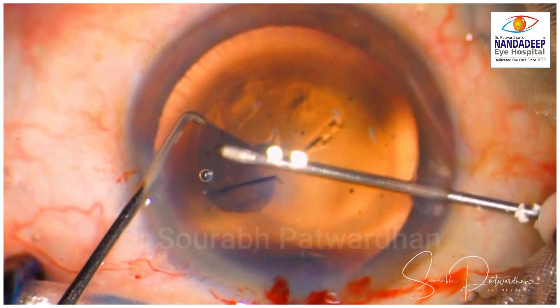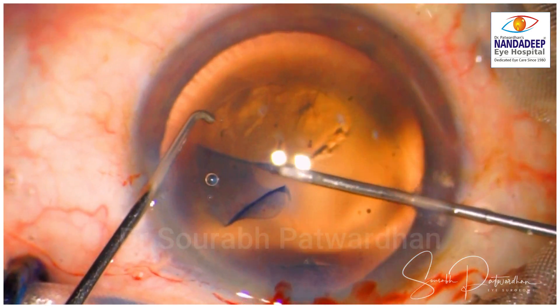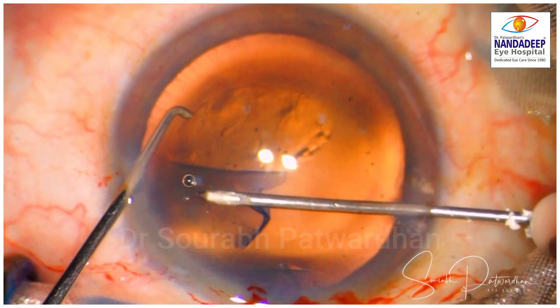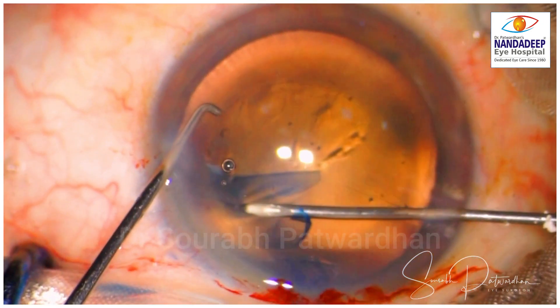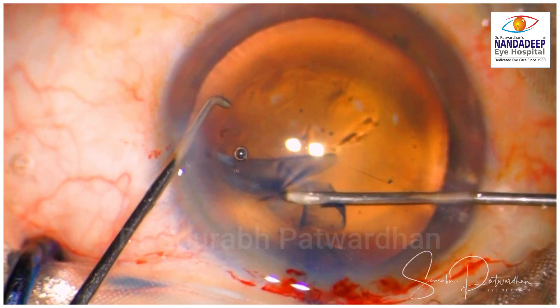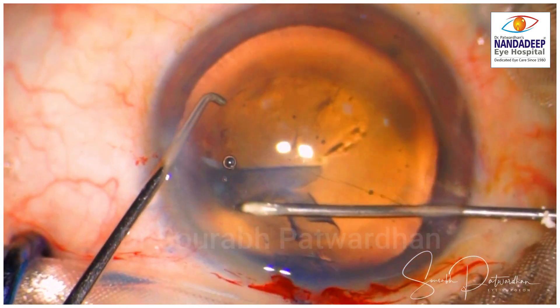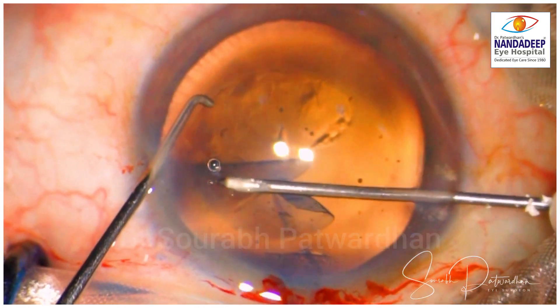He has already started with a big capsulorhexis. Looking at the bigger picture, you will find that the capsulorhexis is already going into the zonules — and there it goes. You can see that now it is stuck into the zonules and it is going to extend.